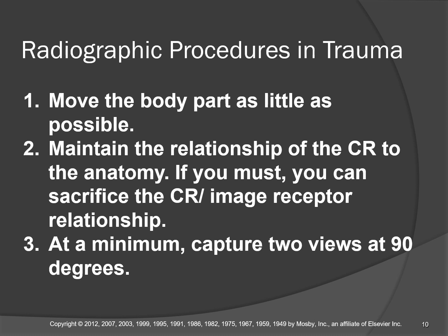Well, you need to do a modified AP, one for the forearm, one for the humerus, or distal humerus and proximal forearm. You really are maintaining the relationship of the central ray to the distal humerus during the distal humerus shot.